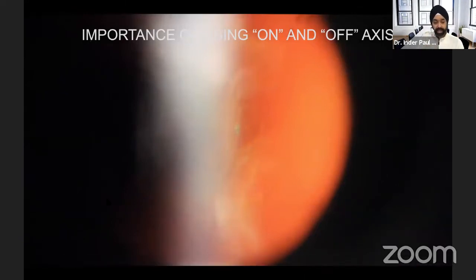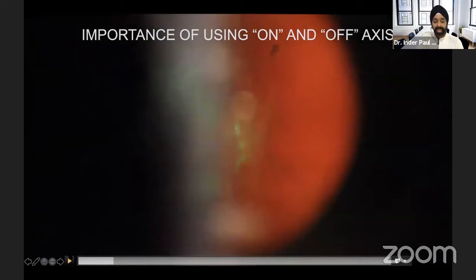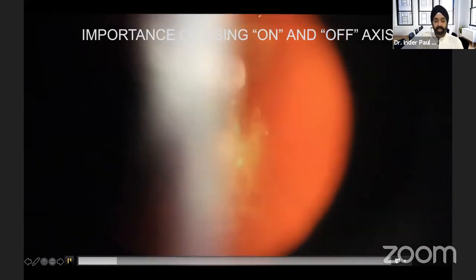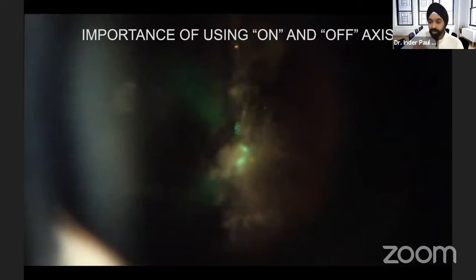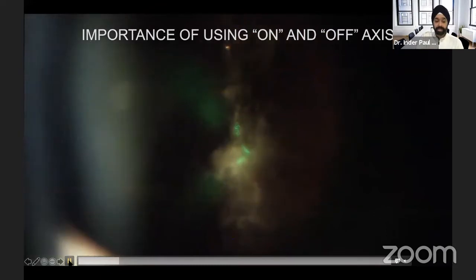And as I'm firing here, I can't see the posterior capsule. Where is the posterior capsule? I don't know. So here's the beautiful thing about the laser: I can actually now turn my slit lamp oblique. By moving the slit lamp oblique, look what I've done. I've moved my coaxial illumination and I've titrated it away. So now I have no red reflex because the floater is right behind the lens. But now I know where the floater is in relation to the posterior capsule.